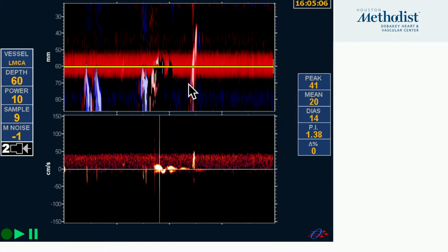While this signal is beautiful, nice and straight, goes all the way to the MCA. And these are the signals when you see again not connecting into the MCA. These are probably picked up from the ECA, from the external carotid. These two are represented by this ACA.